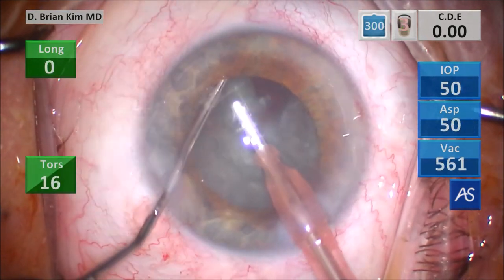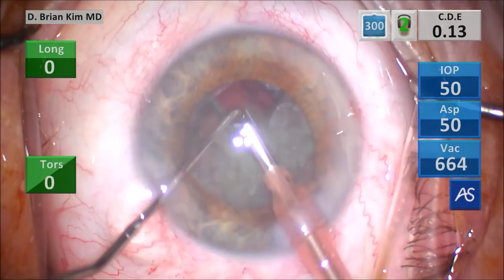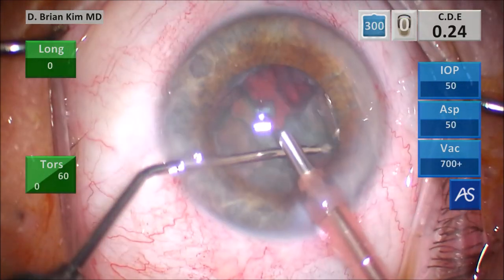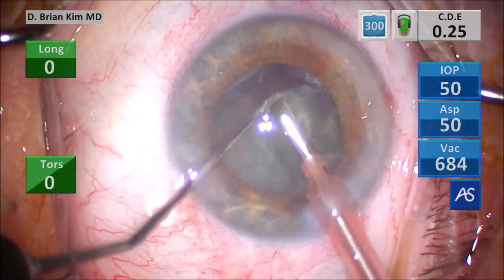That's double chop. Placing the chopper around the right heminucleus, pulling it centrally toward the phaco tip, and then bisecting the right heminucleus — that is cross chop. Use a little bit of vacuum to pull that first quadrant up and emulsify it, placing the chopper around the second quadrant, lifting it up out of the bag.